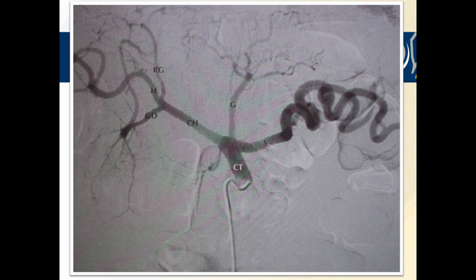Here's a celiac trunk injection, and this is digital subtraction again. Here's the catheter that they're injecting with, and this would be the celiac trunk here. Splenic artery, see how tortuous that is? And then we have that left gastric artery coming off here, common hepatic artery. We have the hepatic artery proper. Here's the right gastric artery coming off of the hepatic artery proper, and this is the gastroduodenal coming down here.